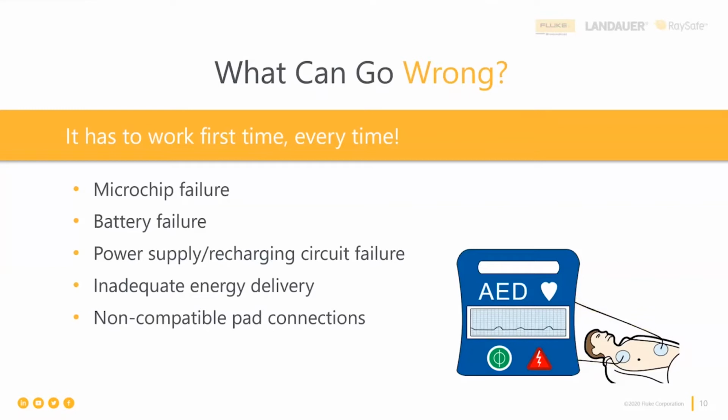I was just last night taking a CPR recertification, and this is a topic we talked about, the continuity of these pads. So if you're treating a patient in your mall, your home with whatever AED you have there, and then the medic gets on scene, they might have to change out the pads. When they're changing the pads on the patient's chest, you have to stop CPR. You have to stop defibrillating and monitoring the patient. If you're operating like a pit crew and doing it really quick, it could be 30 seconds, but that's 30 seconds that you're not beating that patient's heart.